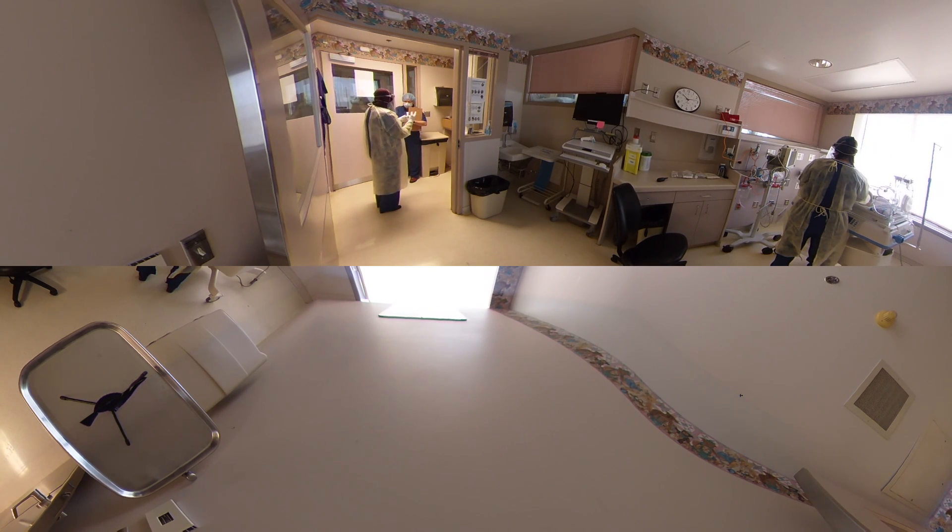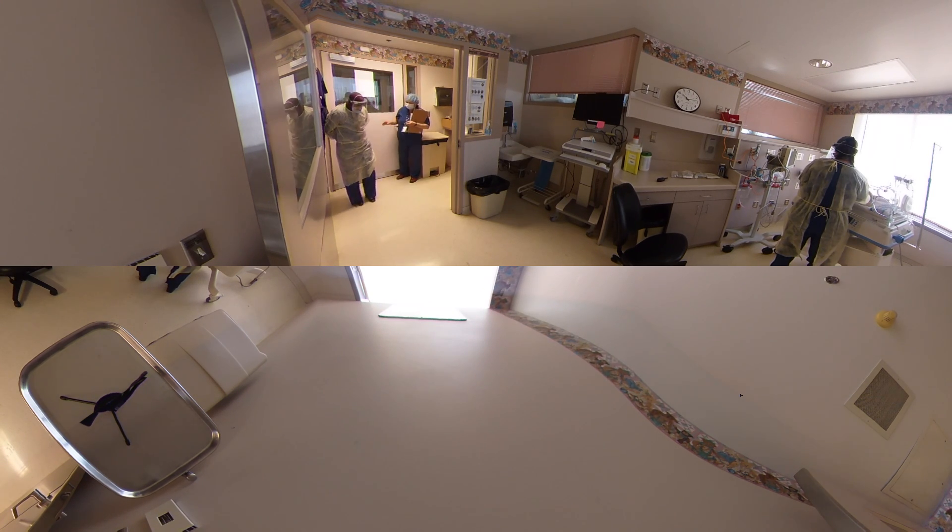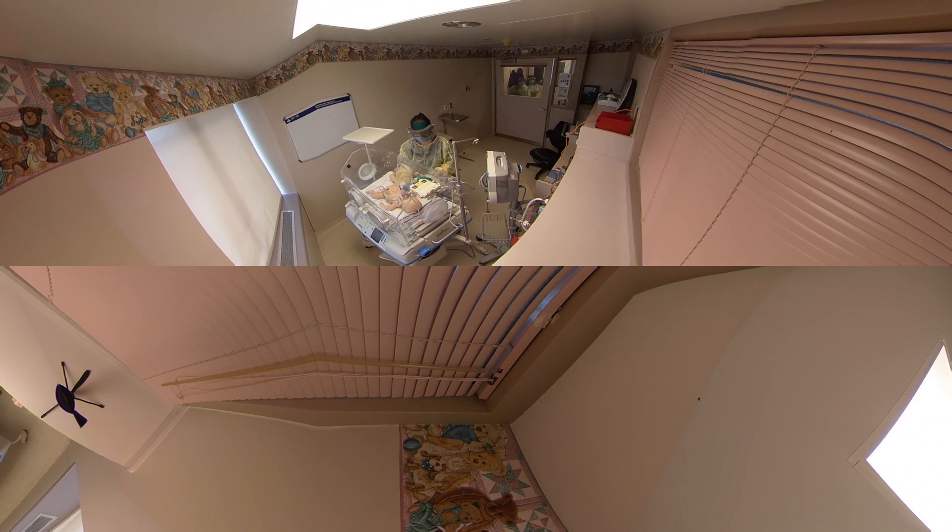Double checking — the only thing is that tie has come loose. Double checking — okay, you're good to go. Our heart rate has improved but the sats are still down.